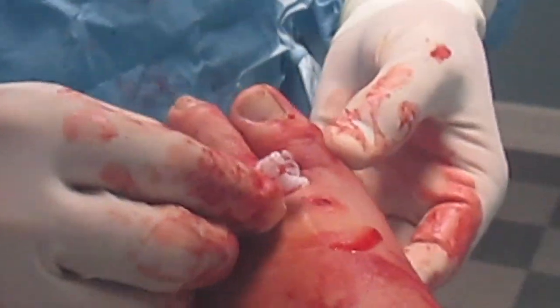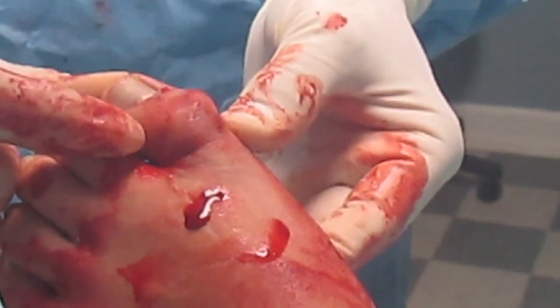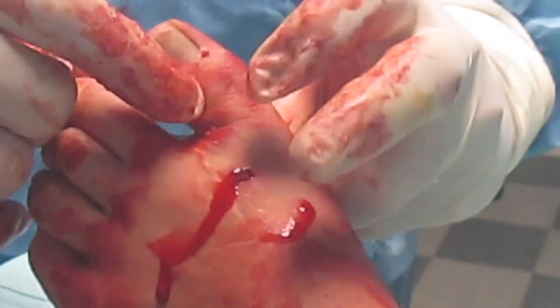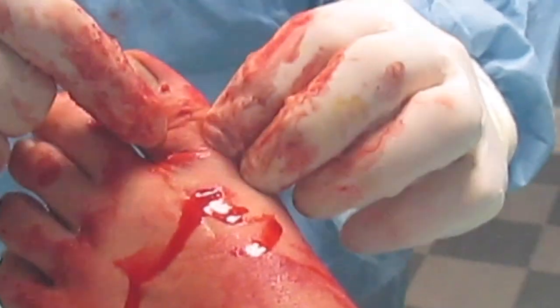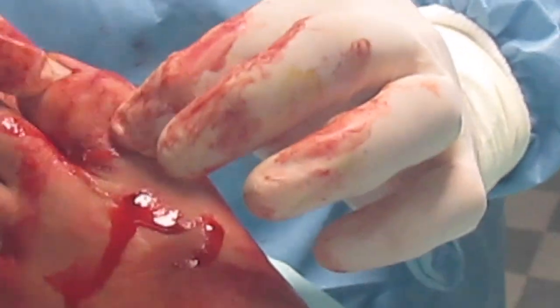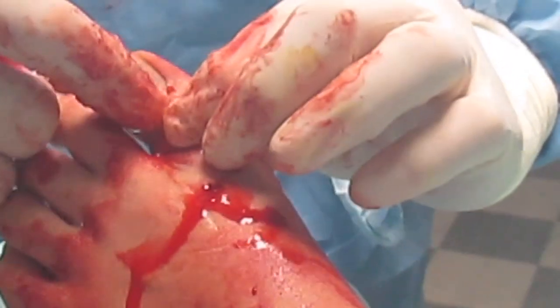Now one thing I do when I do these, you don't have to use K-wires, but because our plantar tendon is going to be pulling, it could make our toe go back into more of a hammer position because we do have mostly a through osteotomy. And when I do Hallux Varus, I do pin this osteotomy, not the first met, but this, just so that if we do have pull in our tendon, it'll prevent the hammer toe from coming back. So it pulls down here and it'll correct this osteotomy here in the best way possible.